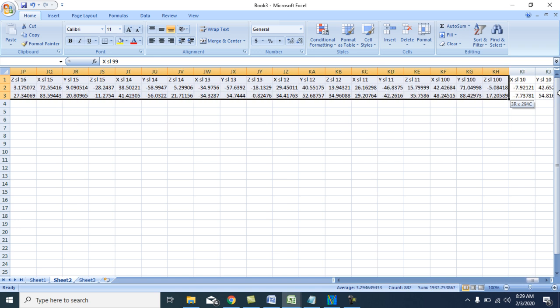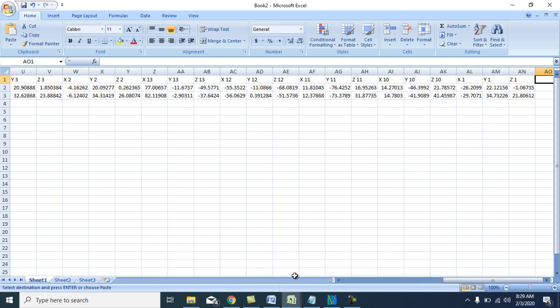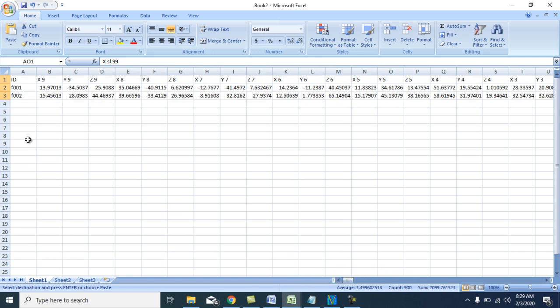So we copy this one to match together with our previous one. So we now have both landmark sets together in one file. Ctrl C, I copy, and come back here. I paste here. You can see. If you have 100 landmarks and 100 subjects, all of them will line down here. This is only for 2 specimens. If you have 10 specimens, that will be here like that.